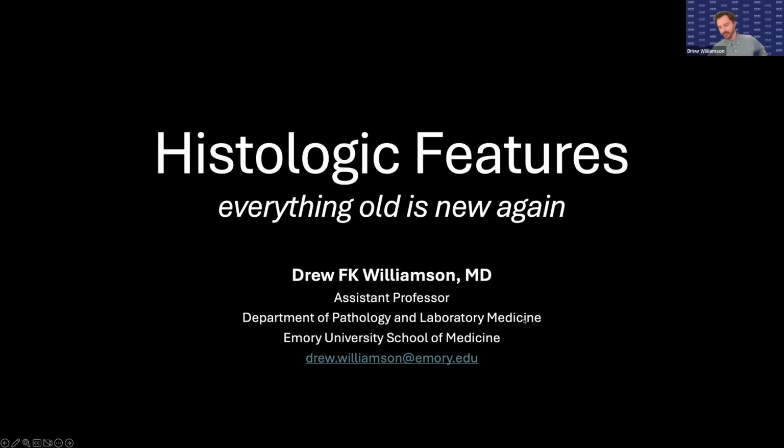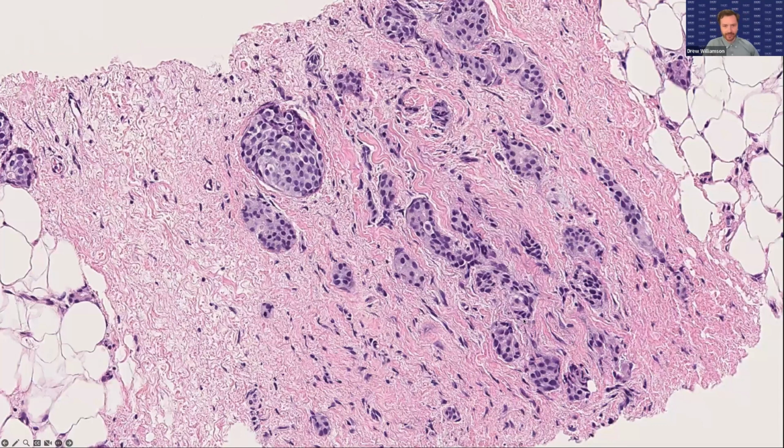Okay, great. A very common thing that happens when you're going through pathology residency, especially at the beginning, is you plop down a slide on the microscope and you're sitting across the microscope from an attending pathologist, and they'll just ask you to describe what you see on the slide. So you've got a slide like this. This is a core needle biopsy of a patient's breast mass.